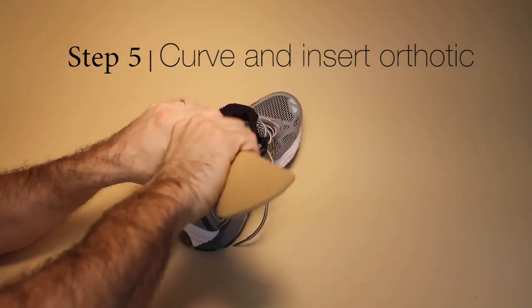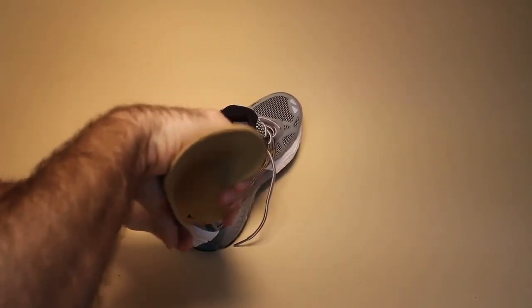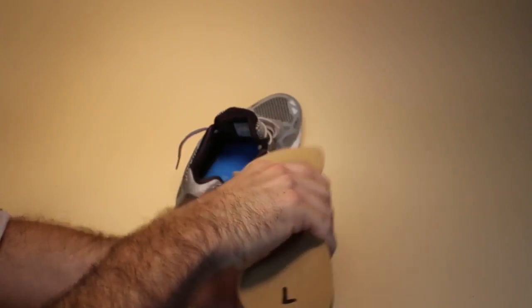Step 5. Curve the device like a canoe. Curve the flanges of the orthoses up by grasping the bottom of the orthoses and applying a firm grip. Repeat until a smooth, consistent curvature of the flange is achieved.